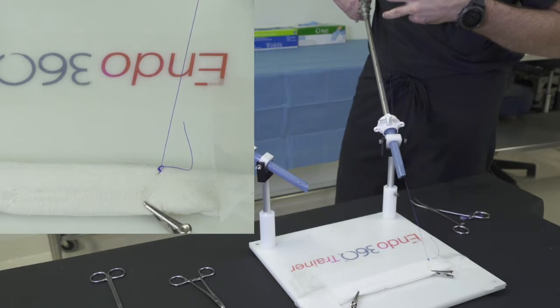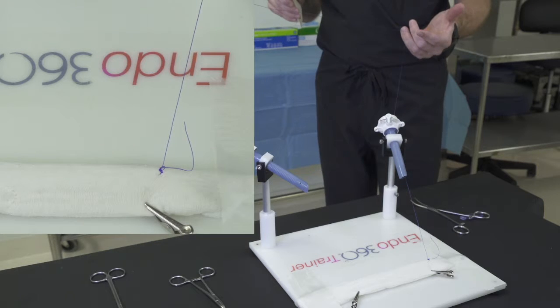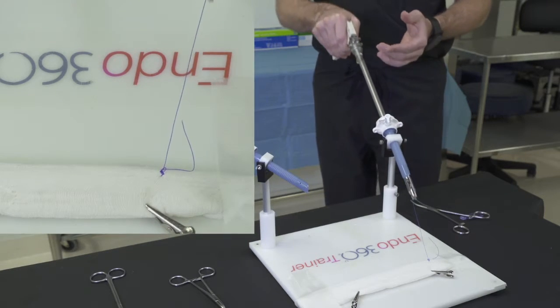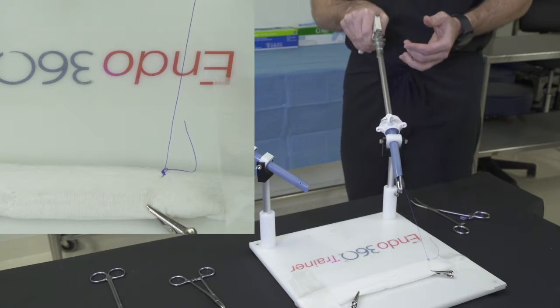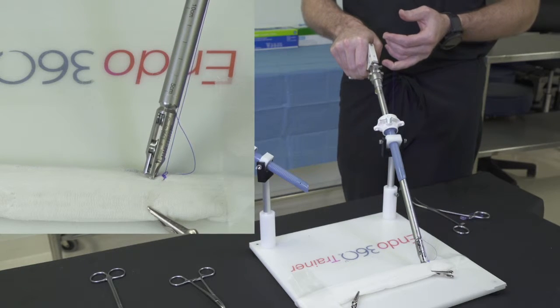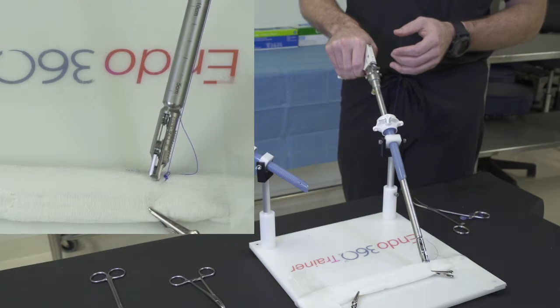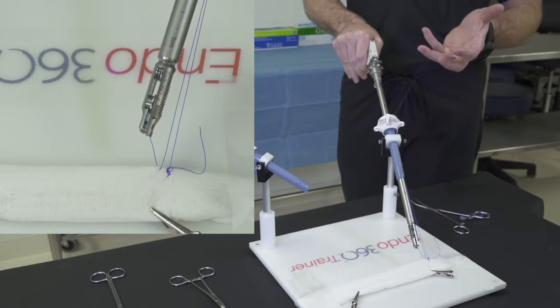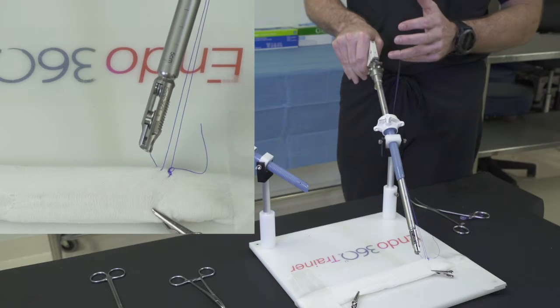Now as I enter, one of the important things is to enter so that you are traveling along where you're going. So if my last suture was right here, as I enter, I actually want to aim to the right. And then I want to come to the location that I'm going to first start. I'll take my first bite, and I'm taking the suture and pulling it just gently so that it doesn't loop or cause any problems.